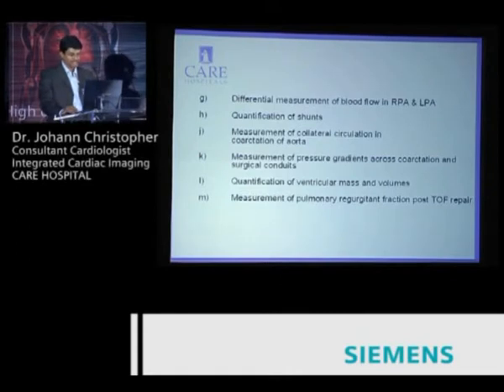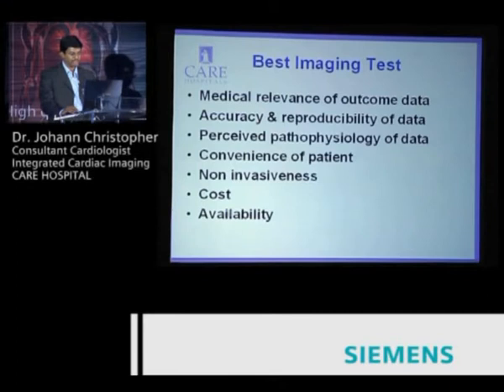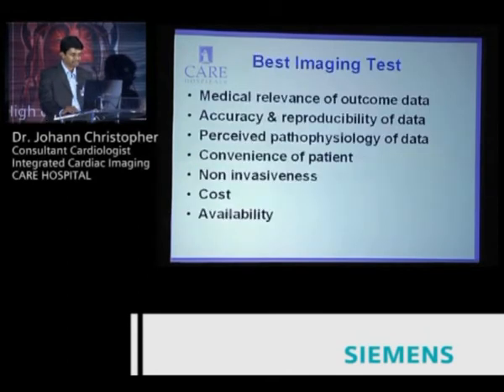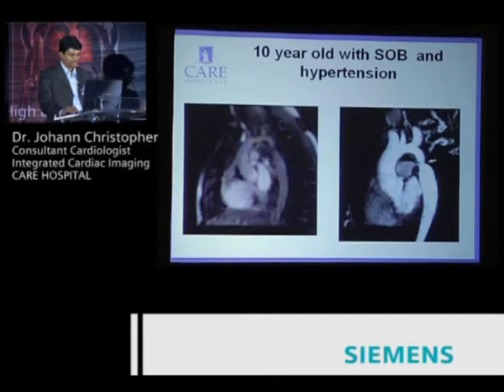The other large kind of study that we are also doing is most of the patients with tetralogy of Fallot 10 years ago or 5 years ago who were operated never got a pulmonary valve annulus, so they have significant pulmonary regurgitation. So we image the RV and the extent of regurgitation and quantify it. So just to tell us about what is really good as an imaging tool, especially for this kind of infants, it also deals with the availability of the equipment and the expertise at the local institution.